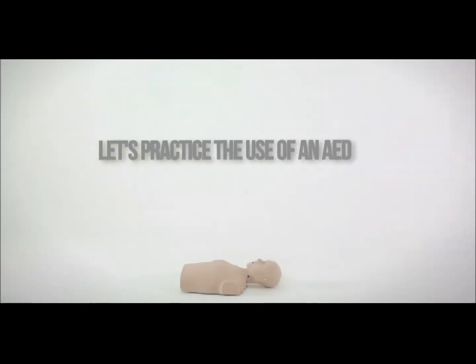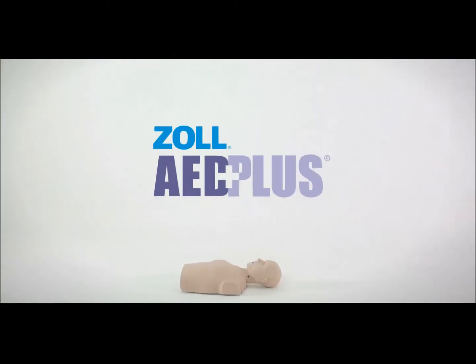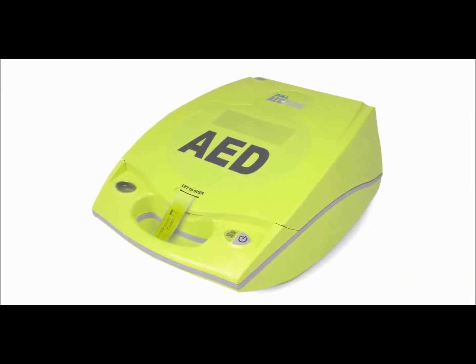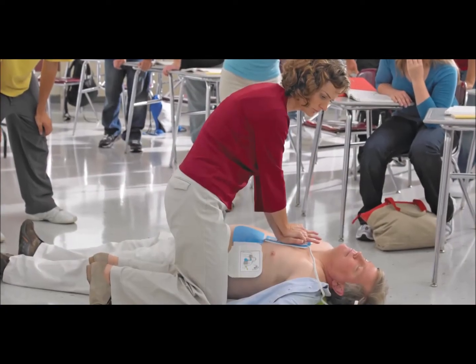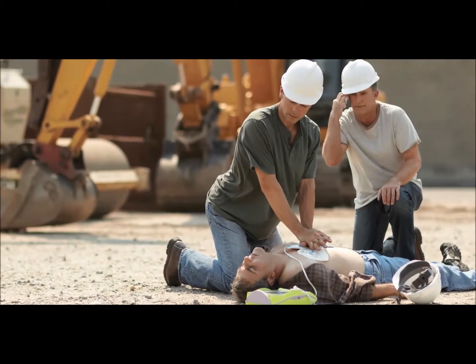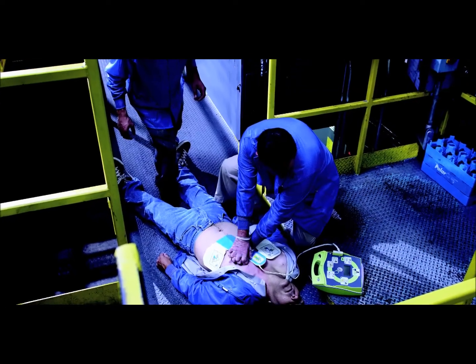Next up, we will practice the use of an AED that has CPR feedback technology. In this scenario we are using the Zoll AED Plus. AEDs with real-time CPR feedback technology give lay rescuers the confidence they need to save lives, while helping rescuers avoid the most common mistakes made during CPR: insufficient chest compression depth and rate.